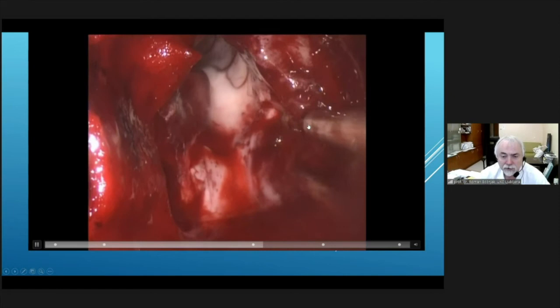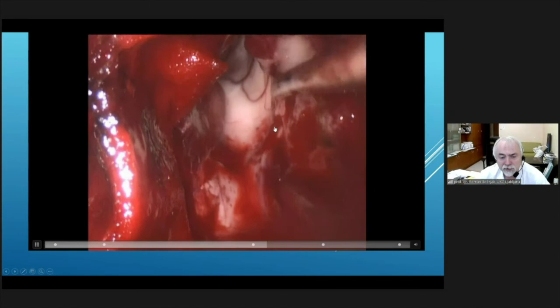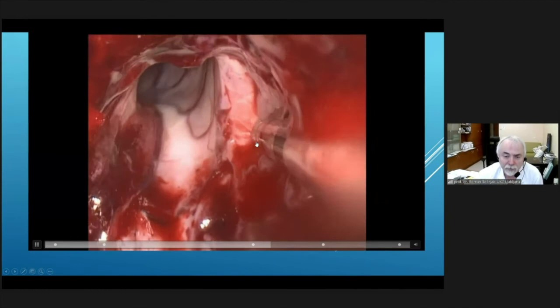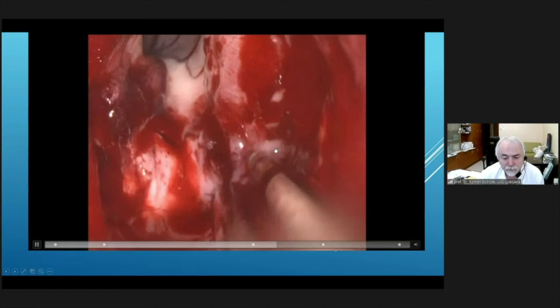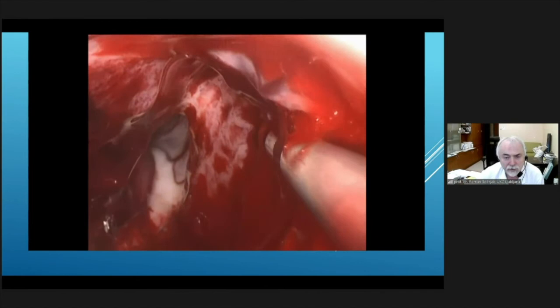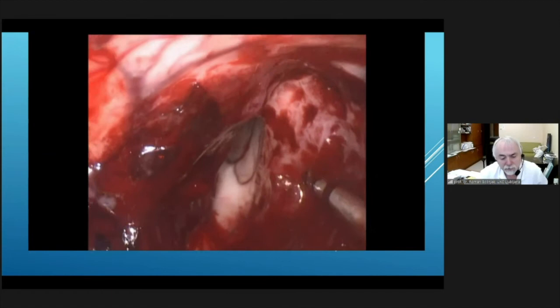The tumor changed color as we came from a different part — the non-enhancing area — into the part that was exophytic in the ventricle with some ring enhancement. We could remove layer by layer at the base of the tumor, moving up toward the corpus callosum. The tumor also extends much farther into the gyrus cinguli, which of course we cannot follow. These are the last parts of the tumor from the roof, and now everything is more or less complete — this was the planned extent and also what the tube allowed us to remove.